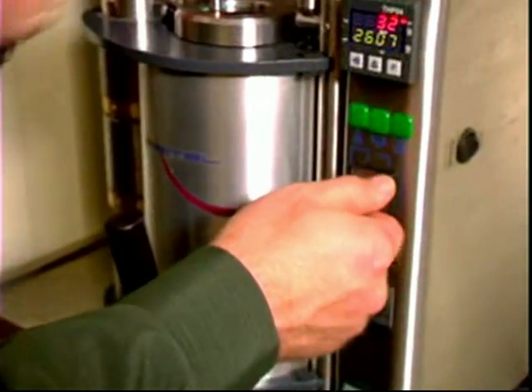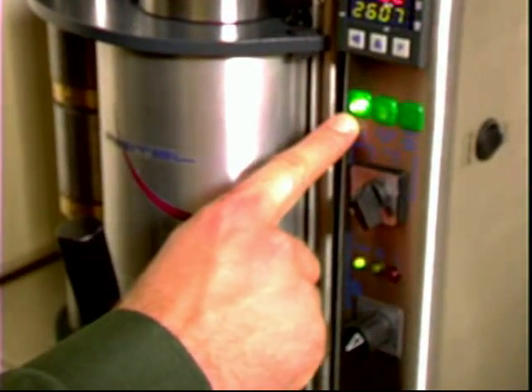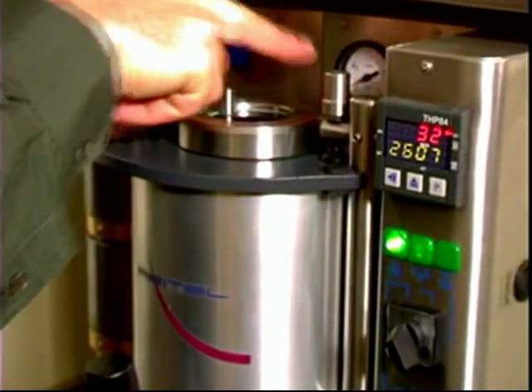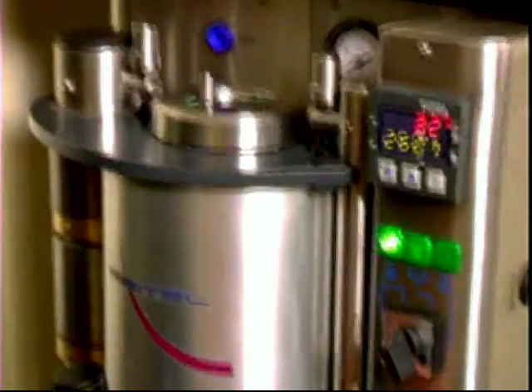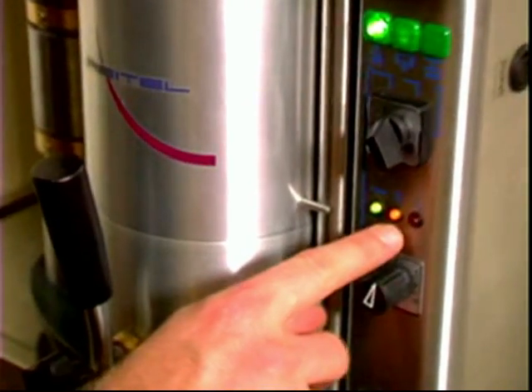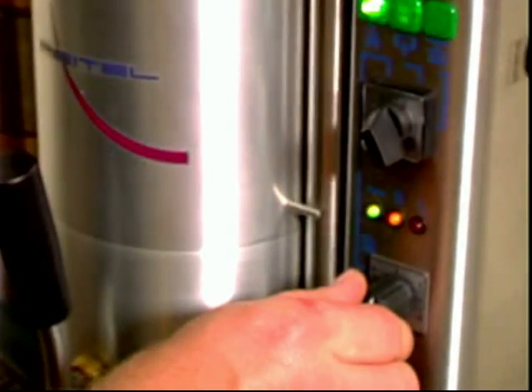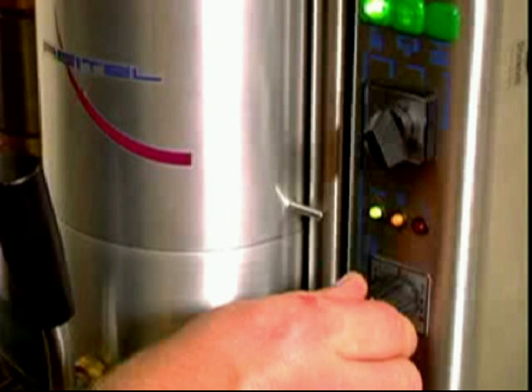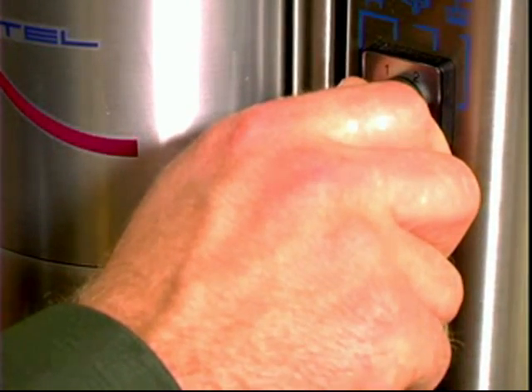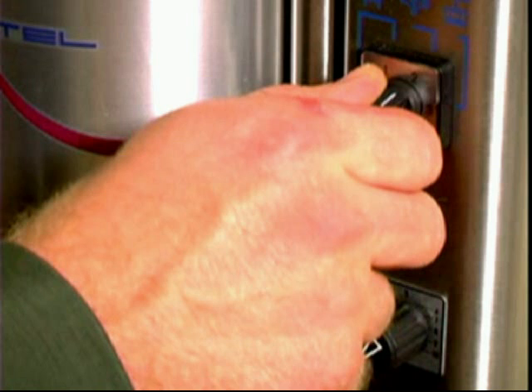To start the casting process, turn the machine to stage one. This light then comes on and it draws the vacuum. Next, turn up the heating element. You'll see the yellow light come on. It will take about 45 seconds to a minute until the machine beeps. When the machine beeps, you turn the switch immediately to stage two. You keep it on stage two for 30 seconds to add proper pressure on the casting. This makes the casting dense and full.